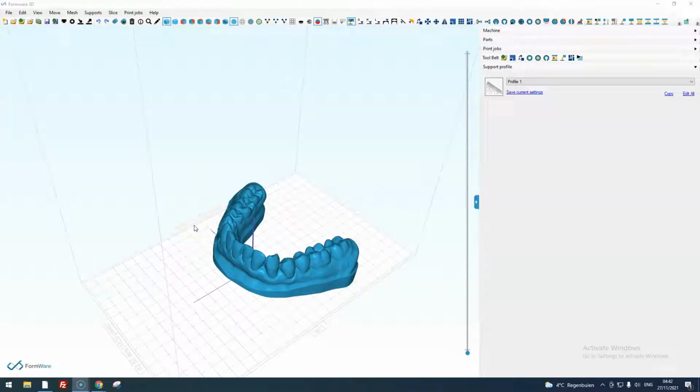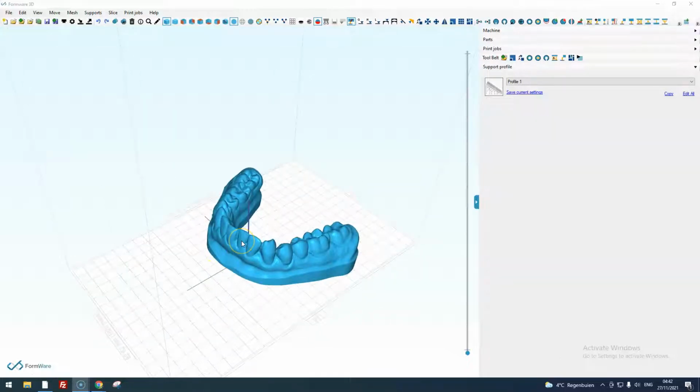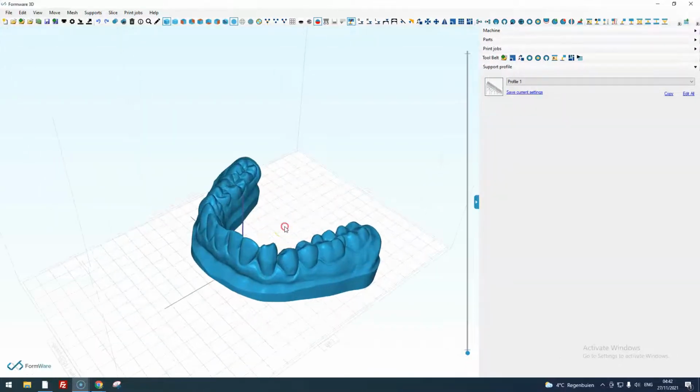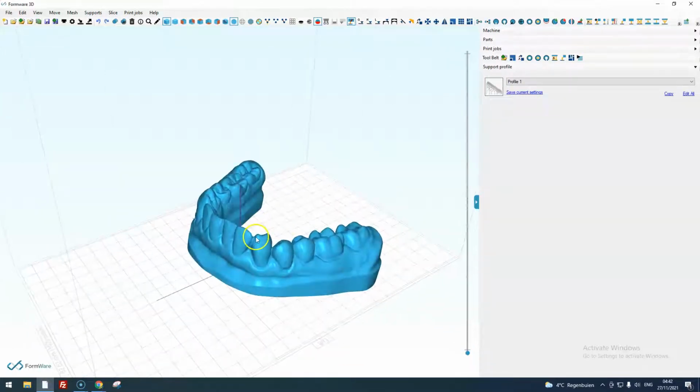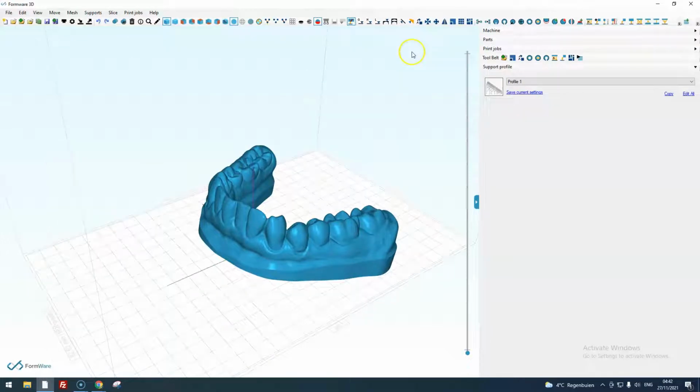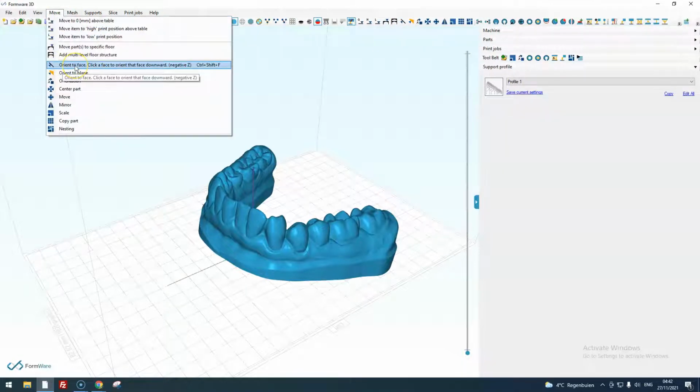In this video, we will have a look at orienting your part for printing and what options there are to do this. I'm looking at this dental part, and the first option that we have built into Formware is orient to face, which can be found here in the toolbar or here in the menu.